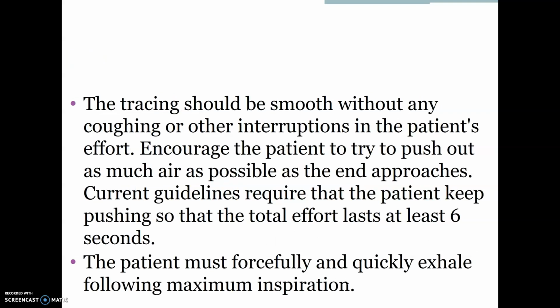The tracings for a forced vital capacity when you're doing a flow volume loop should be smooth without any coughing or other interruptions in the patient's effort. Encourage the patient to try to push as much air out as possible as the end approaches. Current guidelines require that the patient keep pushing air out so that the total effort lasts at least 6 seconds. So PFTs are hard to do for people that have normal lung function, and even harder if they have some sort of lung abnormality. So you really have to do good coaching and show the patient how you want them to breathe. And that expiratory effort does need to last at least 6 seconds.